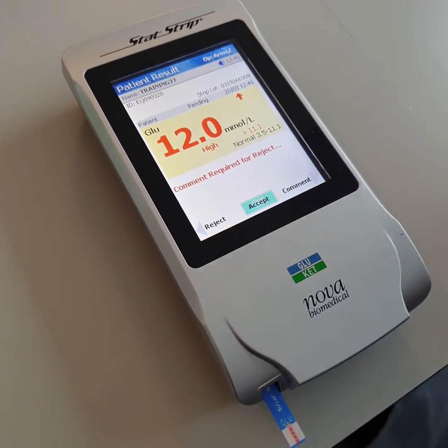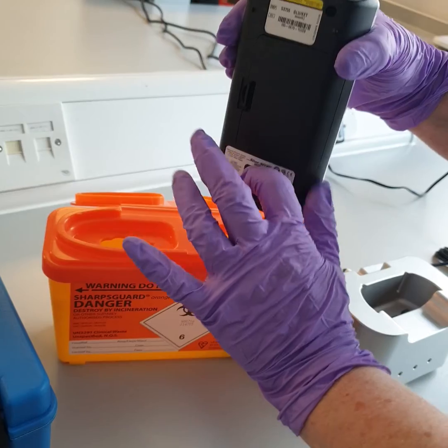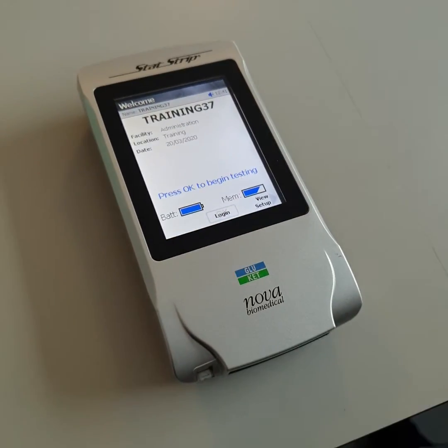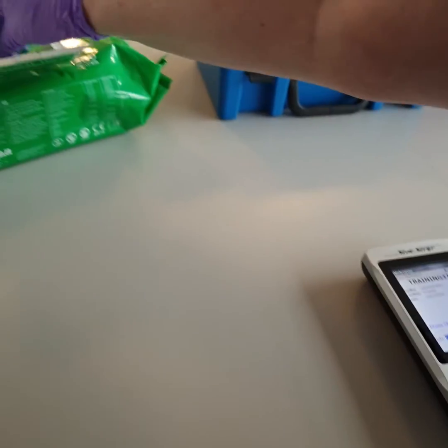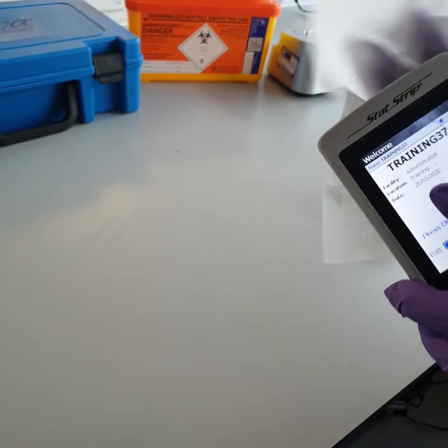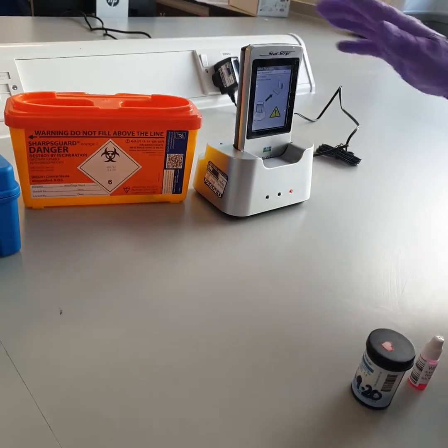When you have your result, click accept. Thereafter, eject the strip into a sharps bin. You then click logout so that no one else can use the meter under your details. Clean the meter after each test with wipes. Then dock the meter so that the results can be transmitted across to your point of care records to keep your barcode active.